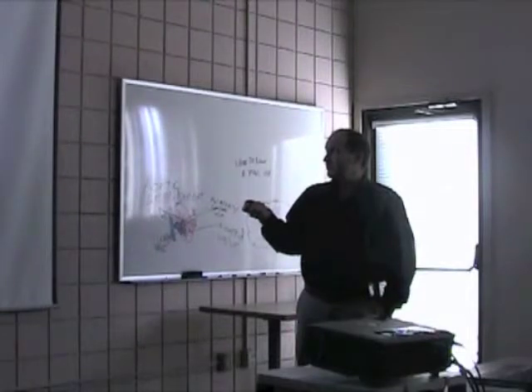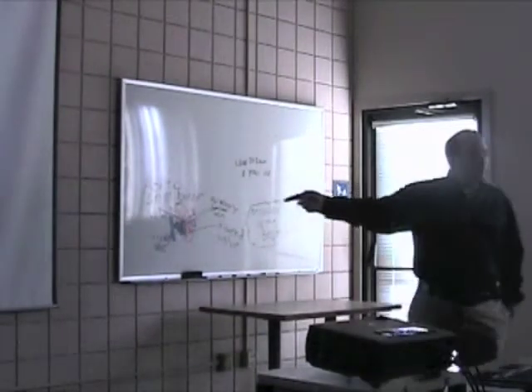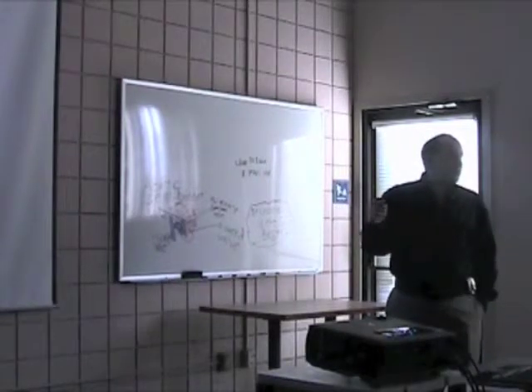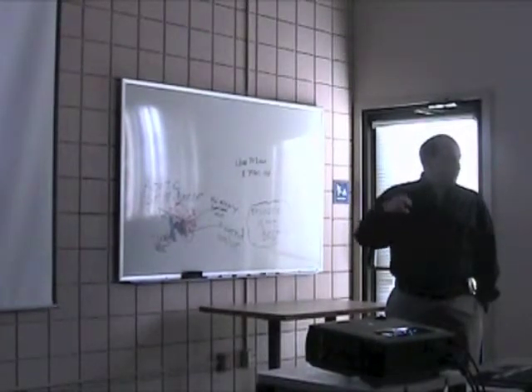Where does the replacement aorta come from? That's it, right there. It's a piece of Dacron. Yeah, that's the most common thing that we use these days. A whole bunch of different fabrics have been tried, and most of them are Dacron these days. Sometimes we'll use that pig aorta that I showed you if we have to do the valve as well. We'll replace the whole thing with that.